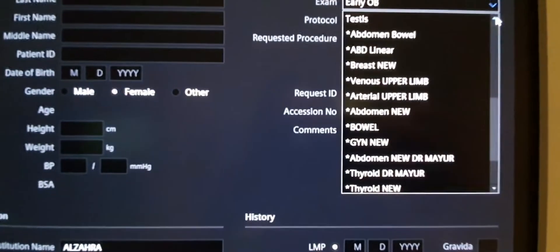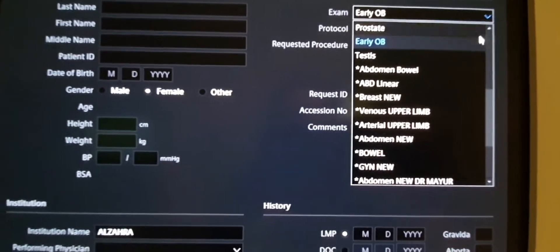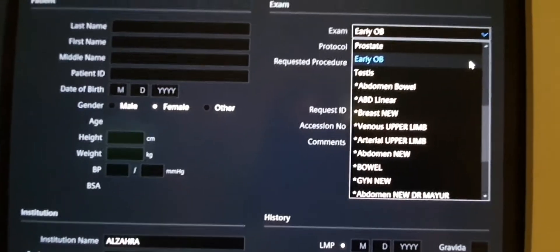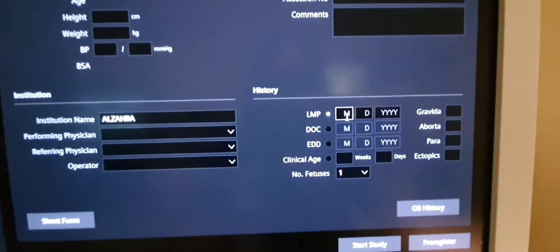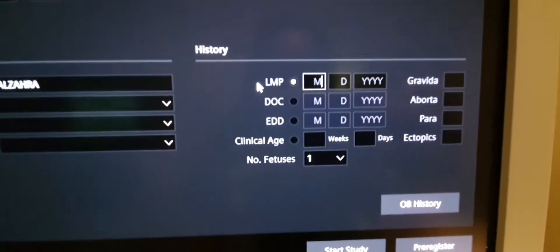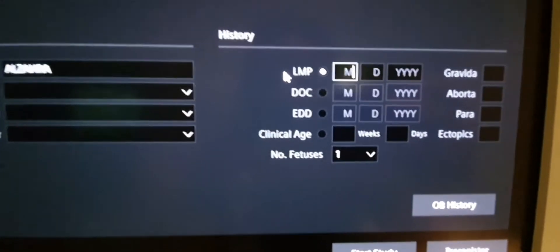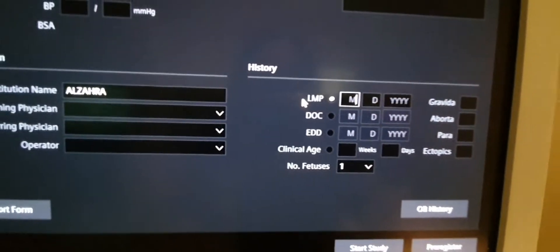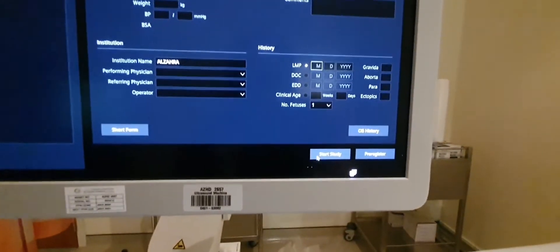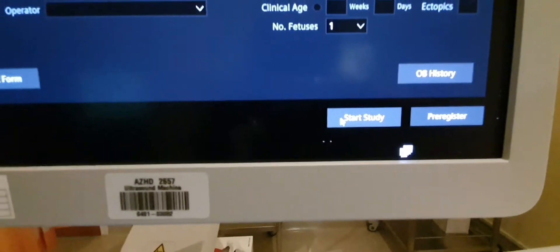For OB patients — pregnancy — you need to select OB and input the first day of the patient's last menstrual period. It will automatically compute the estimated date of delivery. After that, just click 'Start Study'.